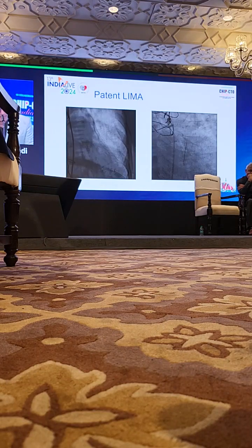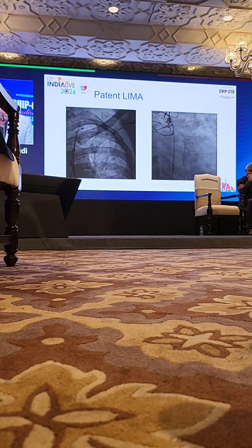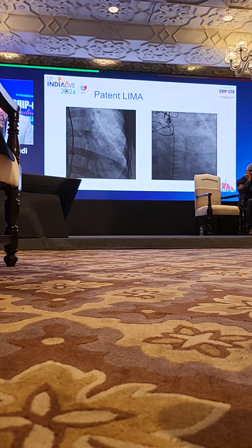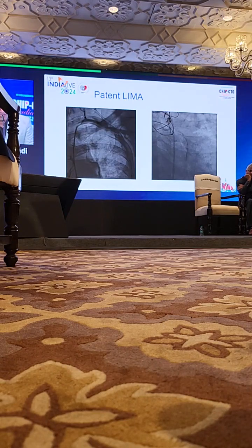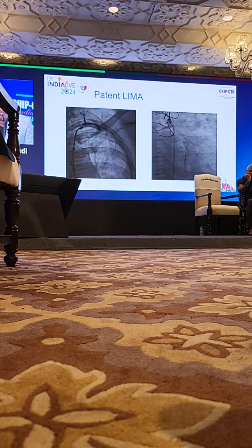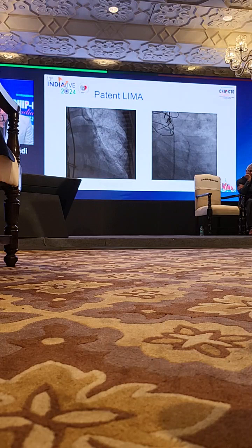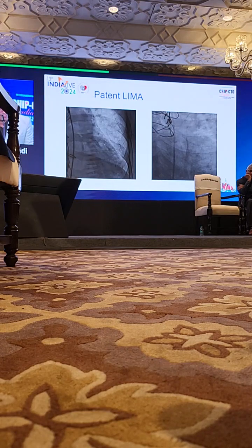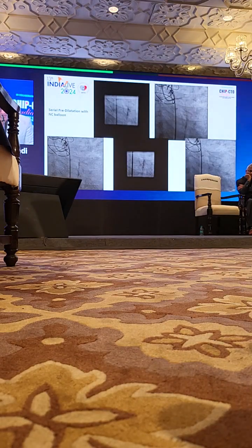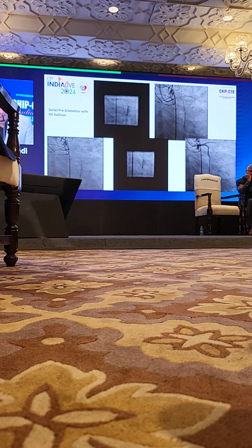I did the angiography, the LIMA was patent, and on echocardiography, her ejection fraction was 45% with anterolateral wall hypokinesia. So I decided to wire the LCX first. I took an EBU 3.5 6 French catheter, took an intermediate wire, wired the lesion, and then I did serial pre-dilatation with a non-compliant balloon. It was done from distal to the proximal side.